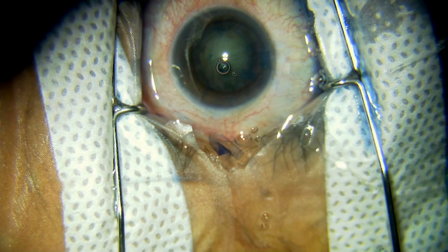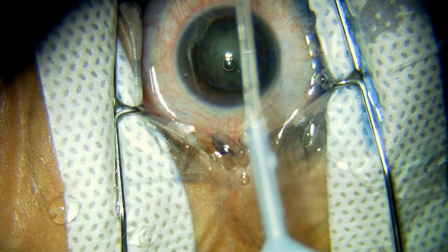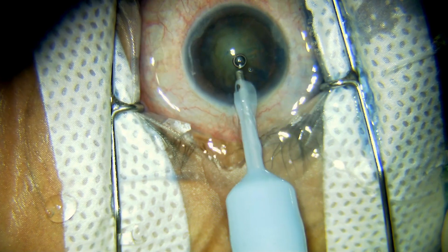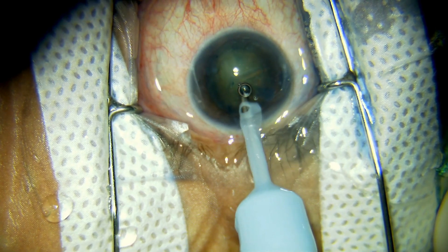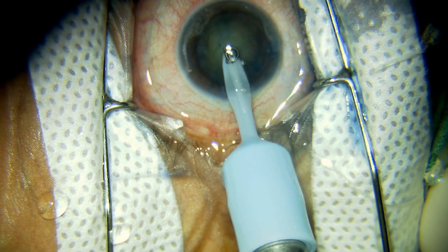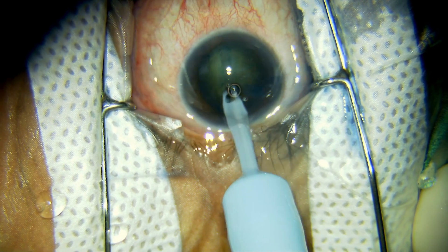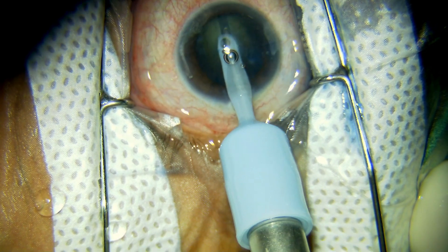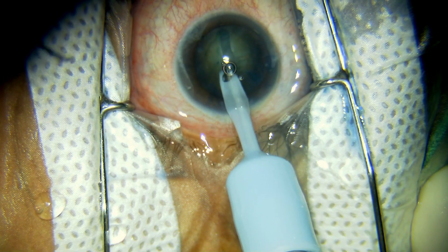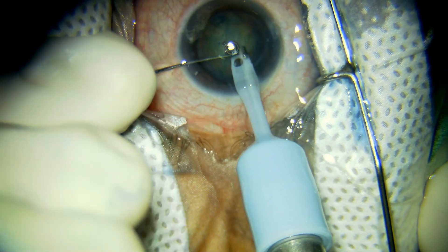The nucleus is rotated. The stop-and-chop technique is being used. Sculpting started in FECO 1 mode with a power of 50% and a vacuum of 80 mmHg. The sculpting needs to be continued until you see the red glow along the entire length of the groove.